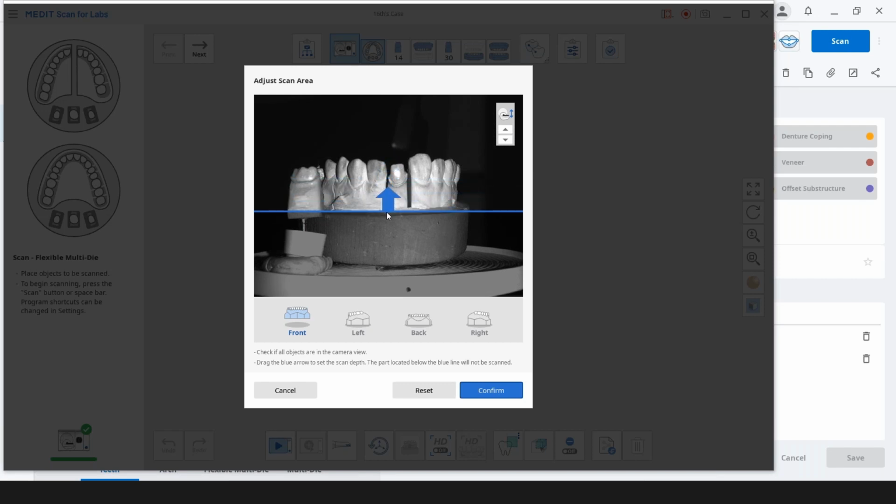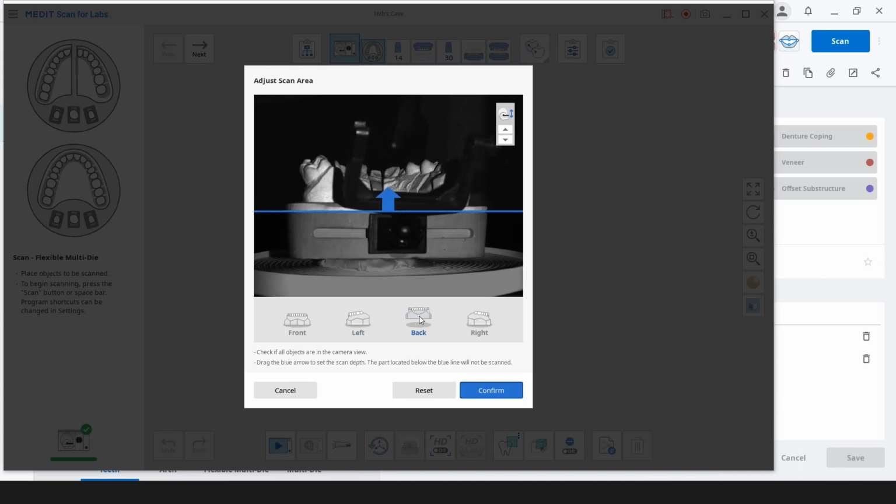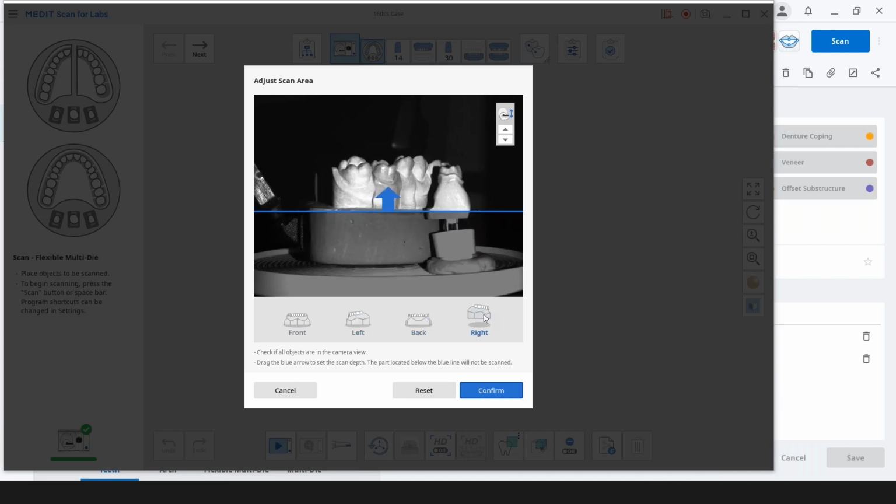All right, and when you have laboratories mounting models by different people, sometimes they're slanted or tilted, and that's where these four options come in handy, because you might want to look at the different position. You can see a very slight tilt to this one, so I know I'm okay. But some models are drastically tilted where it might be interfering with the margin here and then give you a lot of room here in the distal. So you'd have to adjust for that. And I'll show you how to do that. Here's my view from the rear and my view from the right.